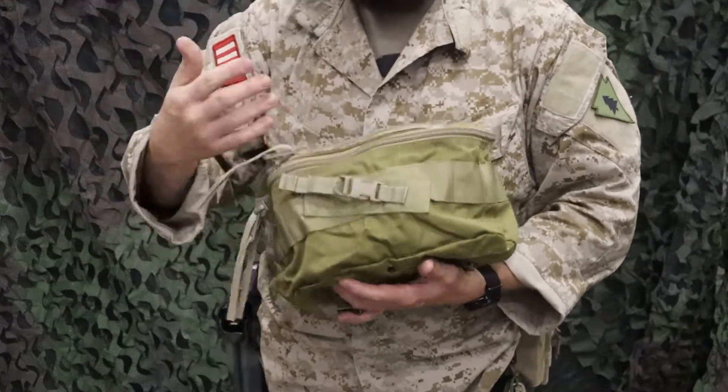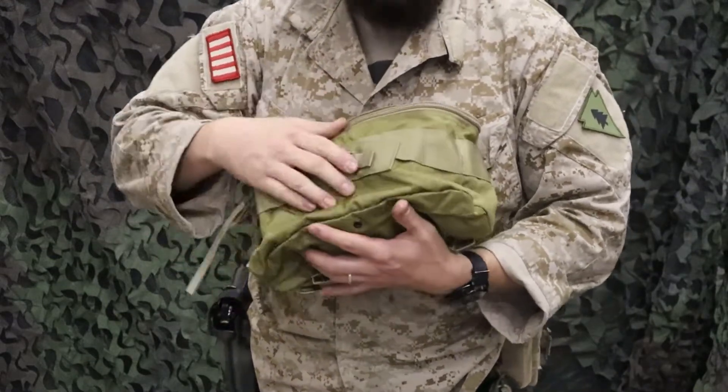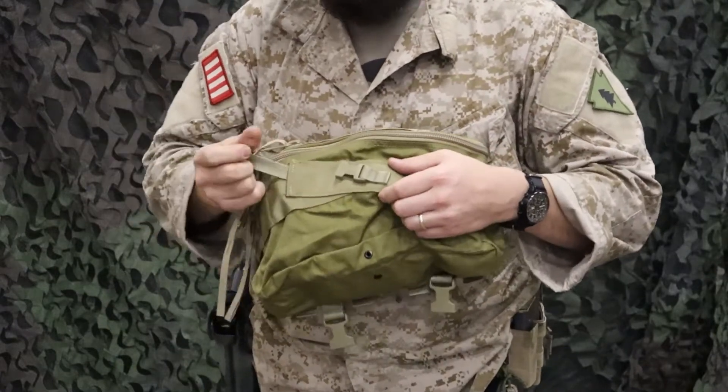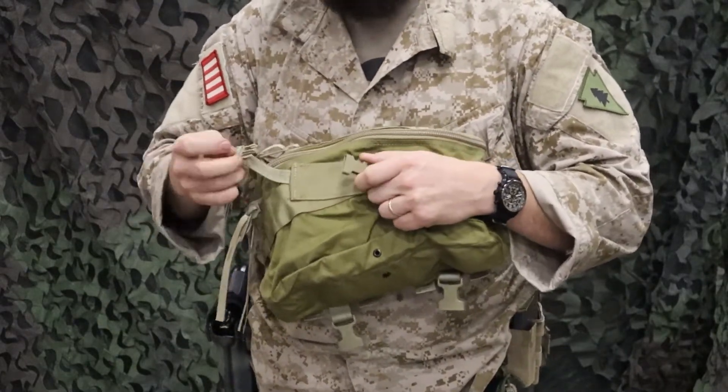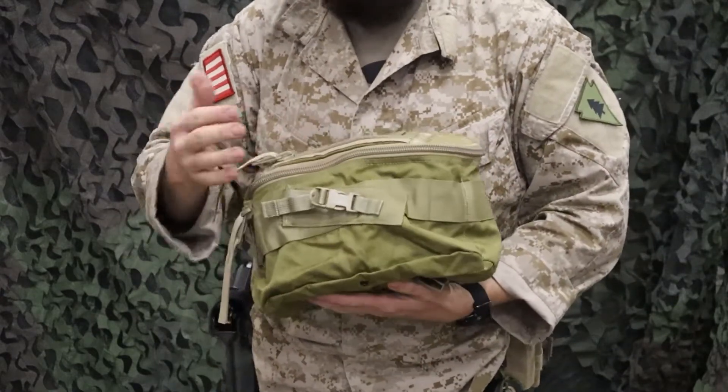So we'll go through it — talk front, back, top, everything going on inside too. From the front, it's pretty basic: you've got a good slot right here to hold trauma shears, nice and secure with this adjustable buckle strap. So you can hold various size trauma shears, nice and secure, easy to get to.